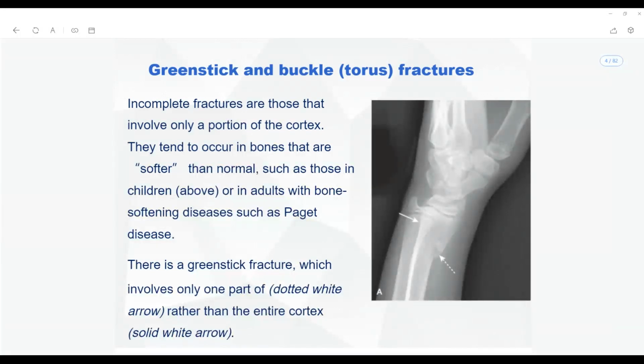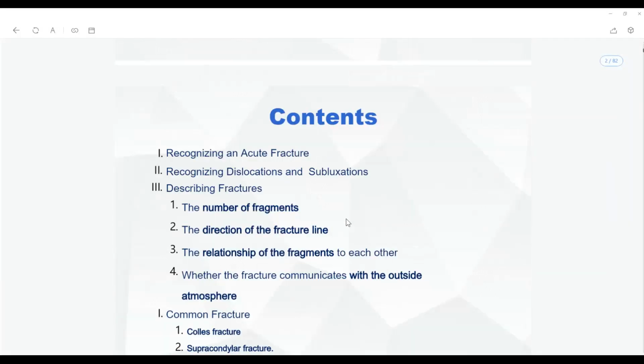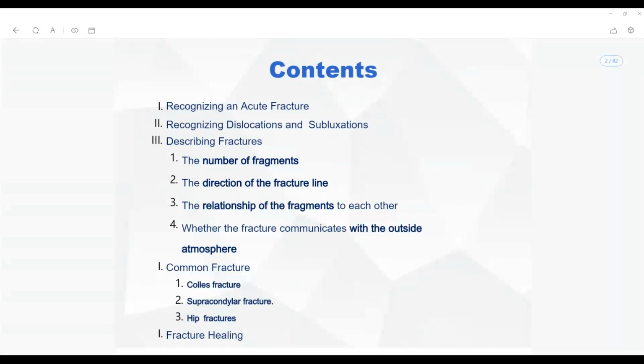Now let's take an example and see why it is necessary when we are looking at a patient in trauma or any kind of musculoskeletal disorder. Is this clear, guys? Please do not forget these rules, because if you do not follow them, the x-ray is going to give a misdiagnosis. Let us see how.